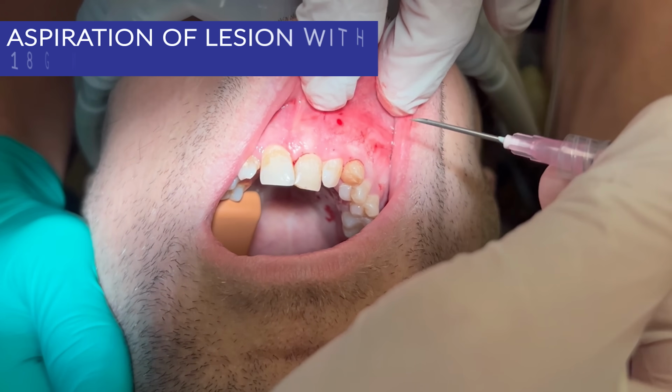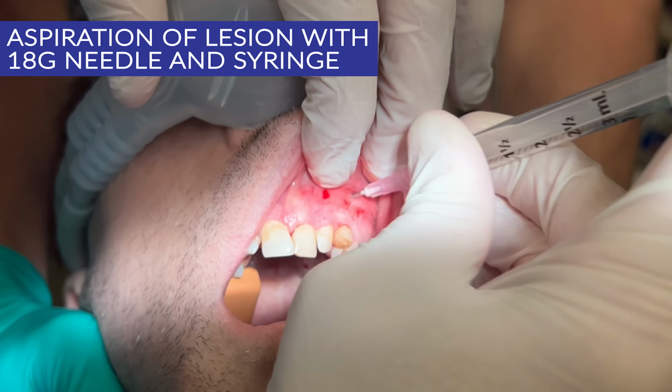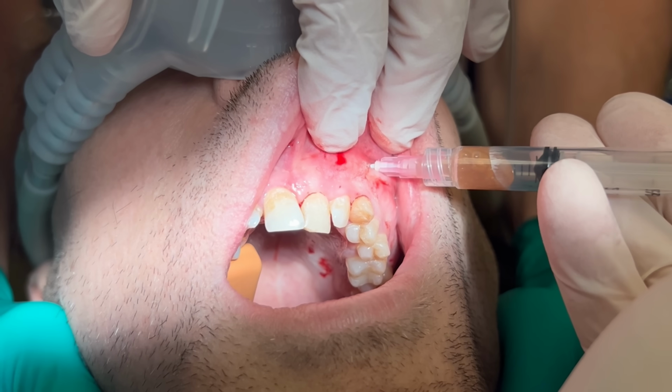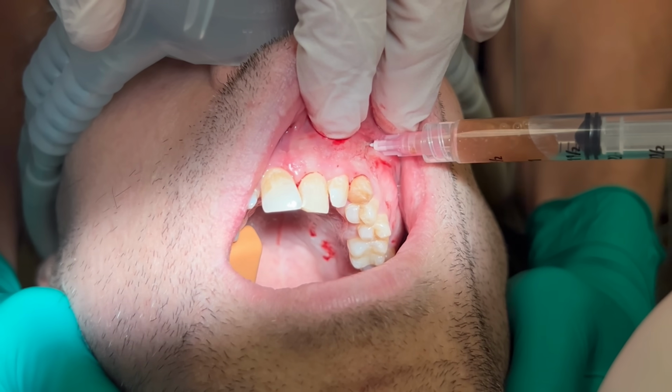Once the patient is asleep and the area is anesthetized, I aspirate this lesion to evaluate the contents. We can see there is a thick brown substance within the lumen of this lesion, and the 3 cc syringe fills quickly.